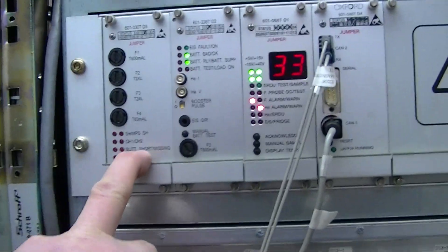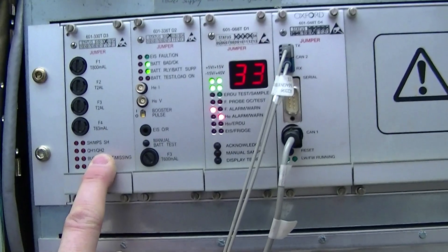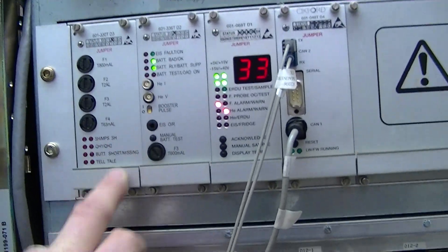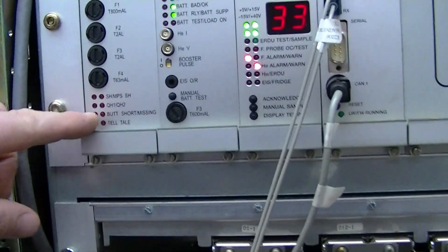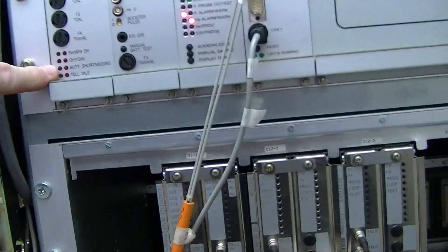Right here is called your D3 board. This is what monitors your quench heaters, switch heaters, and the magnet supervision. It also has what's called the telltale fuse. If the quench button was pushed, that light will come on.